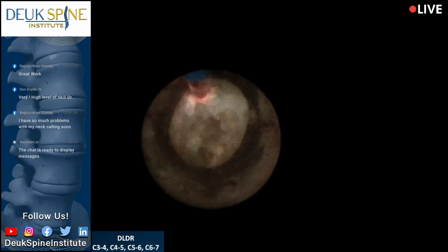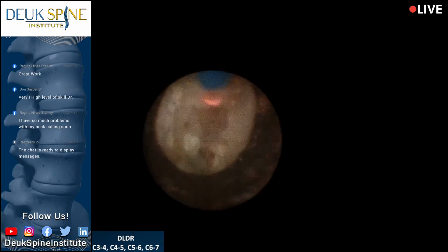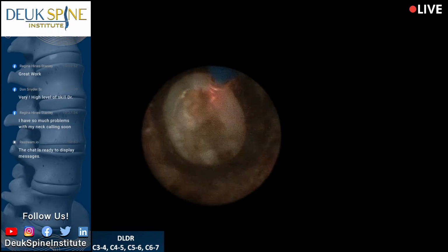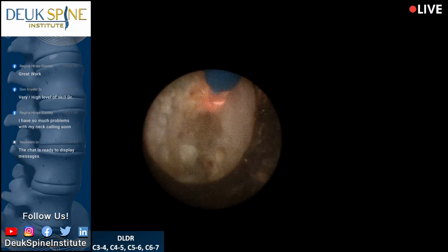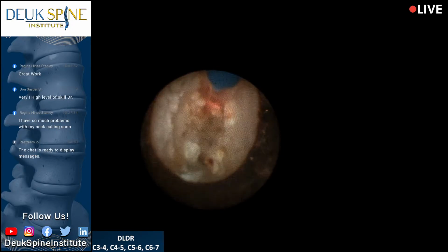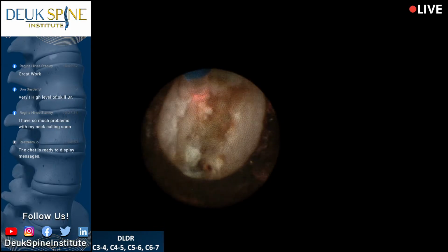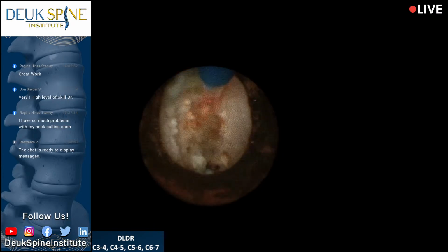See how we get a little bit of movement? We got about 1/2 degree. And I'm just going to remove all this herniation here. It's all scarred up. We call it collagenized when it's scarred up. This is old. So we got a mixture here of old and new. This patient has herniated this disc probably 30 to 50 times over his lifetime. And each herniation has its own age. You know, the birth of a herniation, it has its time. And this part here, down here, is like really old. Really old, like 15, 20 years old.